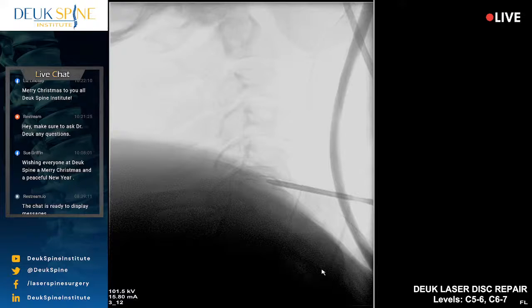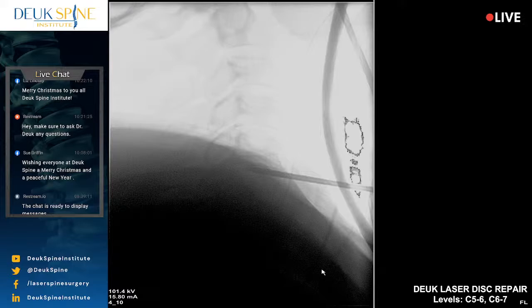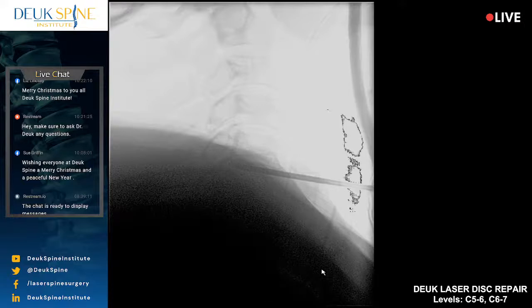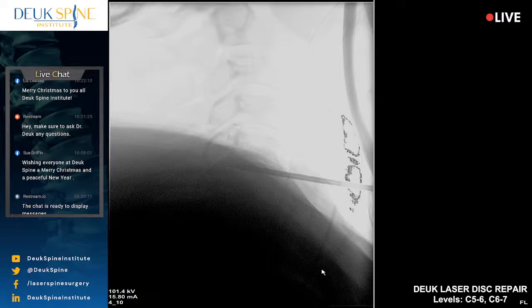I can feel this dilator going in, and it feels like the disc is pretty scarred up. Now, the scar tissue in the middle of the disc that I'm feeling is not a problem. It doesn't cause pain. It doesn't cause neurological symptoms. I'm just noting it for the record, so to speak. But the scar tissue at the back of the disc is the one that causes the pain in the neck and the arm symptoms. Once again, we're going to do everything through a tiny 4mm tube. All of this surgery is FDA approved. Everything we use is FDA approved.